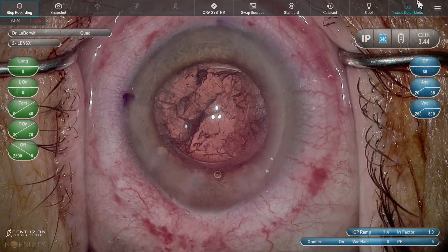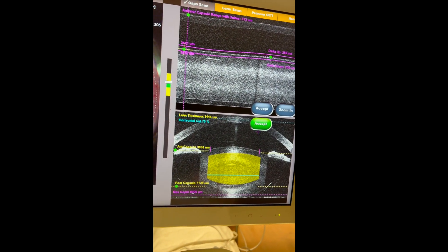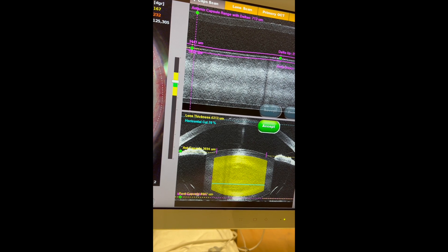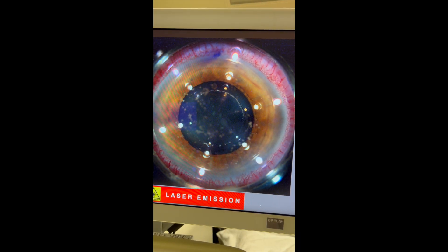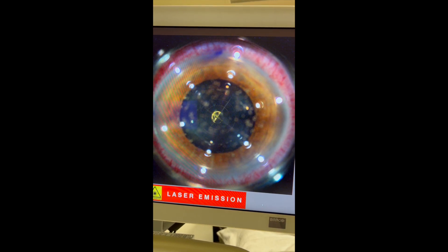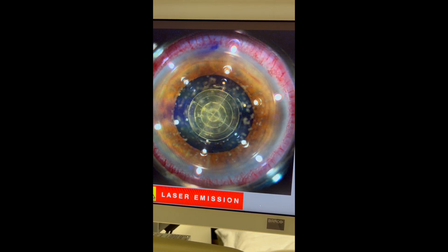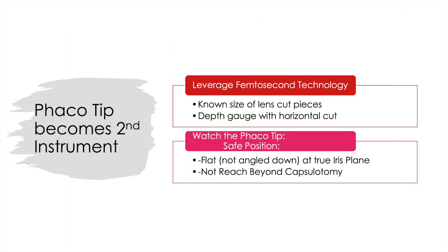If you rewatch the surgical video you'll see the phaco tip stays mostly at the iris plane and doesn't extend beyond. Over time I evolved to have the horizontal cut at 70% depth — you can see the teal line is even deeper into the yellow area — and I've created strategy around this to lift up more of the anterior pieces and ease removal of the bottom part. So you can see creating the cylinders at 4.7mm and the horizontal cut at 70% depth. The phaco tip becomes a second instrument because there is now a known size of lens with cut pieces and a depth gauge while doing surgery with that horizontal cut.